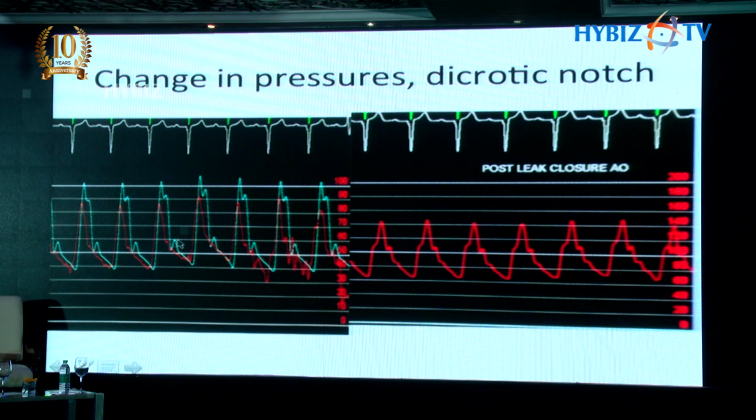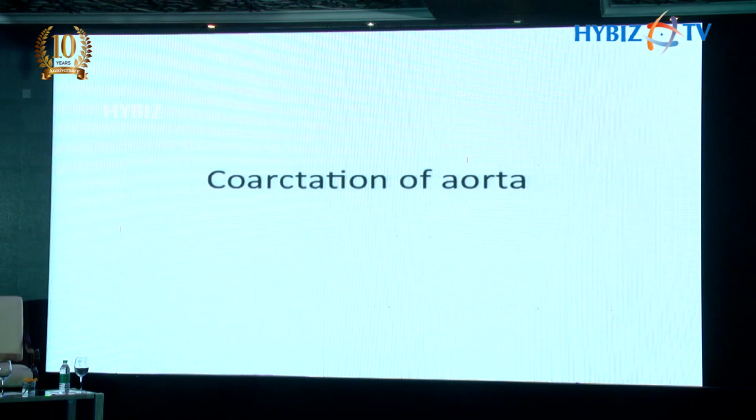Previously, the aortic diastolic pressure is quite at a low level. Immediately after the procedure, the aortic diastolic moves up. Look at the aortic systolic pressure. It's walking around 90 to 100 prior to the procedure. It improves to 140 to 145 post-leak closure. So a tremendous amount of information is given by the hemodynamic tracings, which tell you whether the patient is stable enough, not just simple gradients.